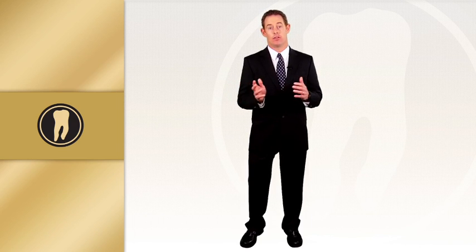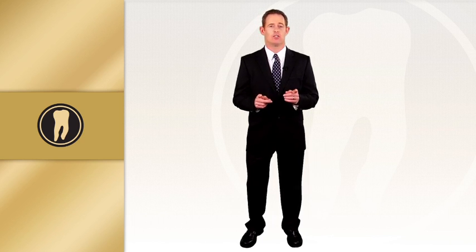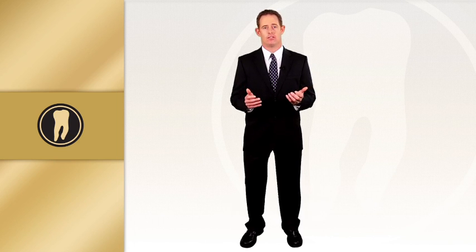I've got tips and tricks on the whole process. We will talk about the tools you should be using. I'll give you some pointers on how to get profound anesthesia, and we will even take a few moments to talk about rubber dam placement. My goal for you after watching this webinar is to be comfortable and confident in your next anterior access, which will contribute to your overall root canal success.